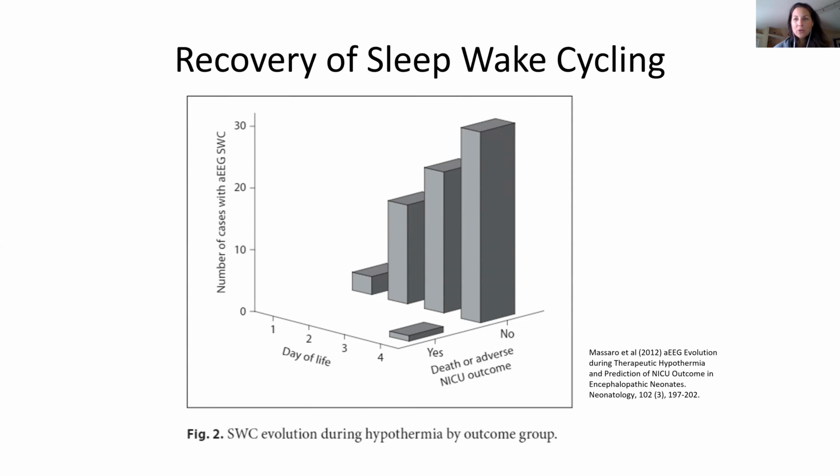So are you guys trending this in your nurseries? Are you trending the return? Are you documenting that when it comes up on aEEG? What are you all doing related to that? Tell me. I know that some of you are here in chat. If you want to unmute yourself, happy to hear from you. What are you guys doing? Anyone? You can text it in as well. It's fine if you're not in a quiet place. So are you guys looking for this return of normal trace? Are you looking? Yeah, so Tess, yeah, we are.